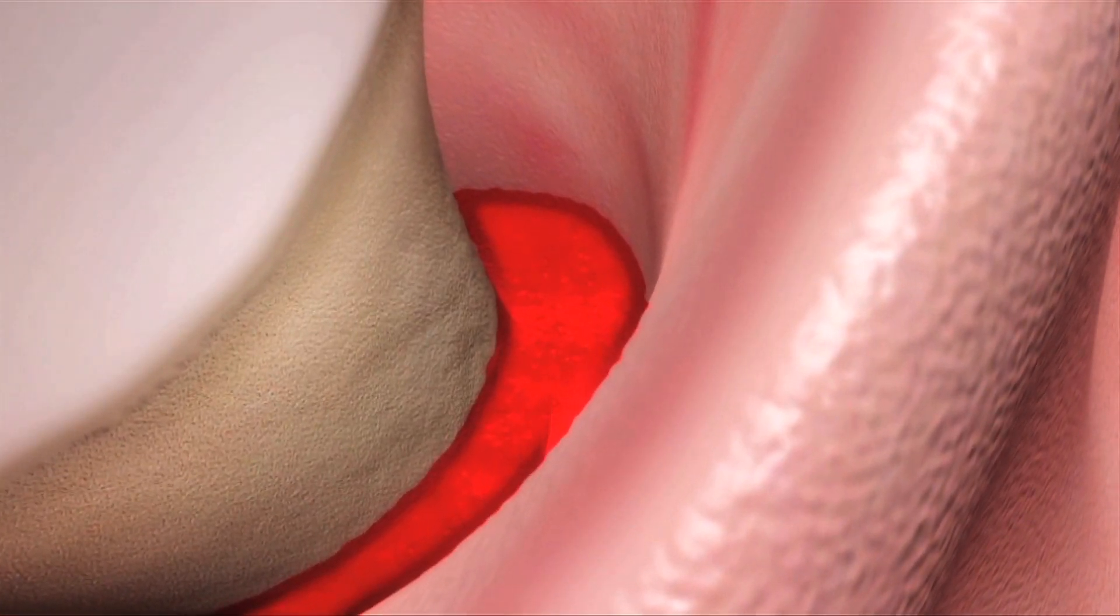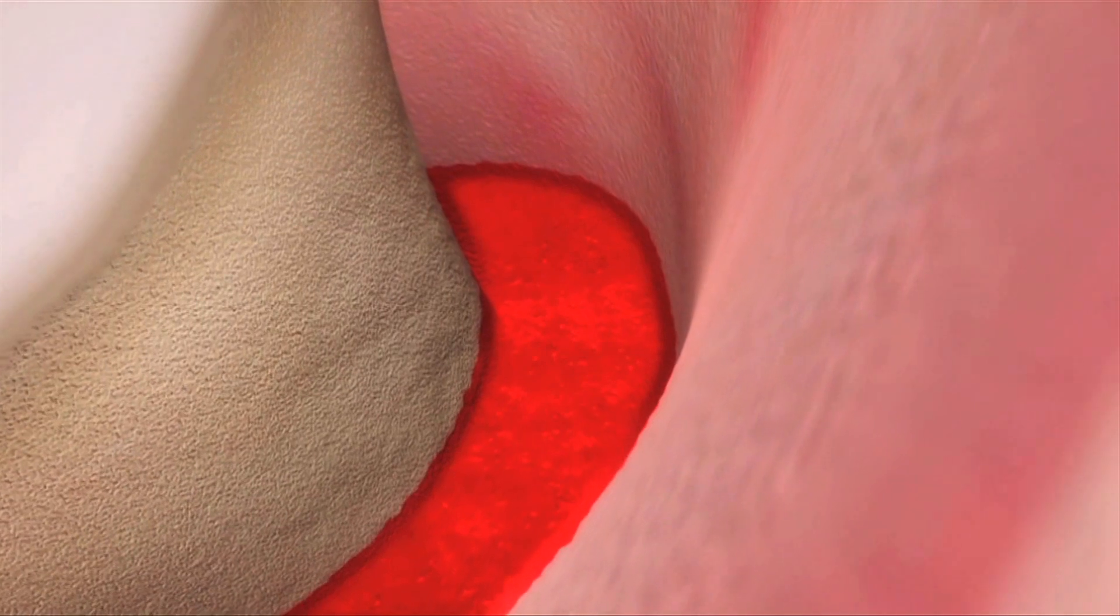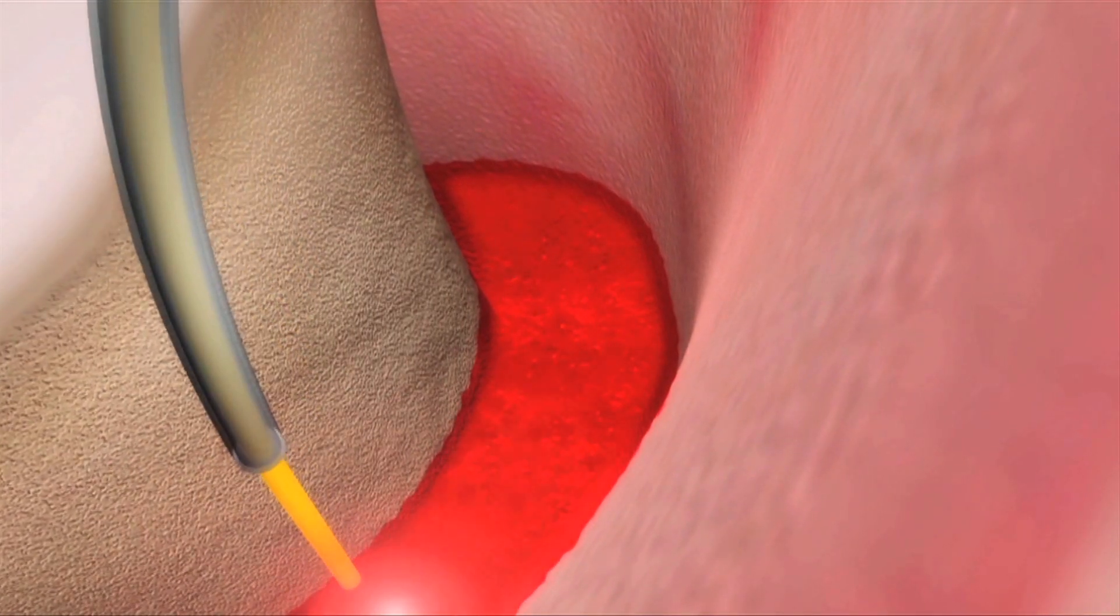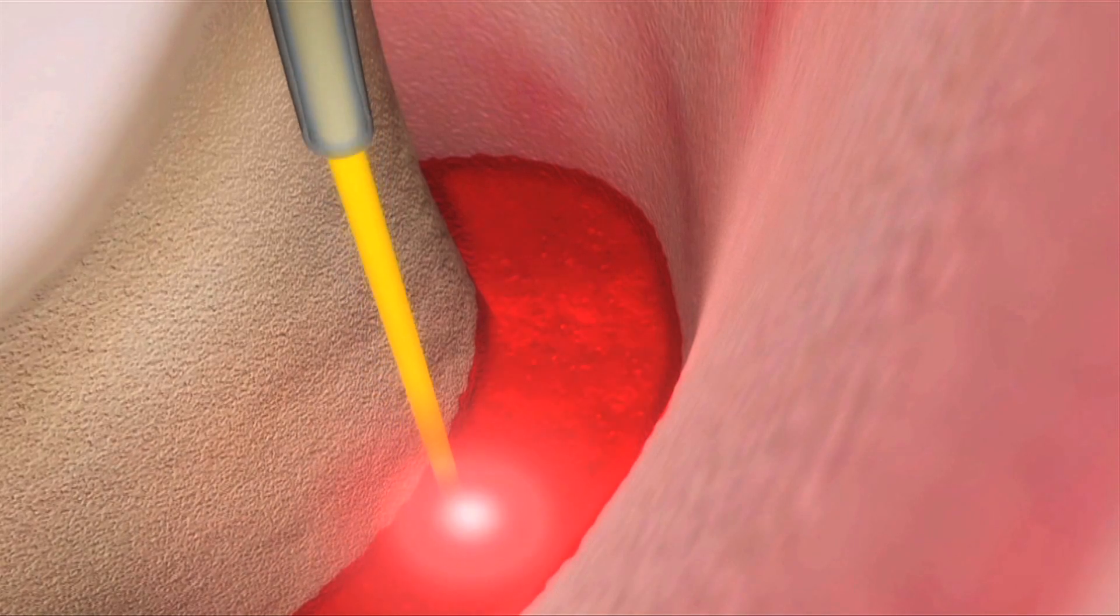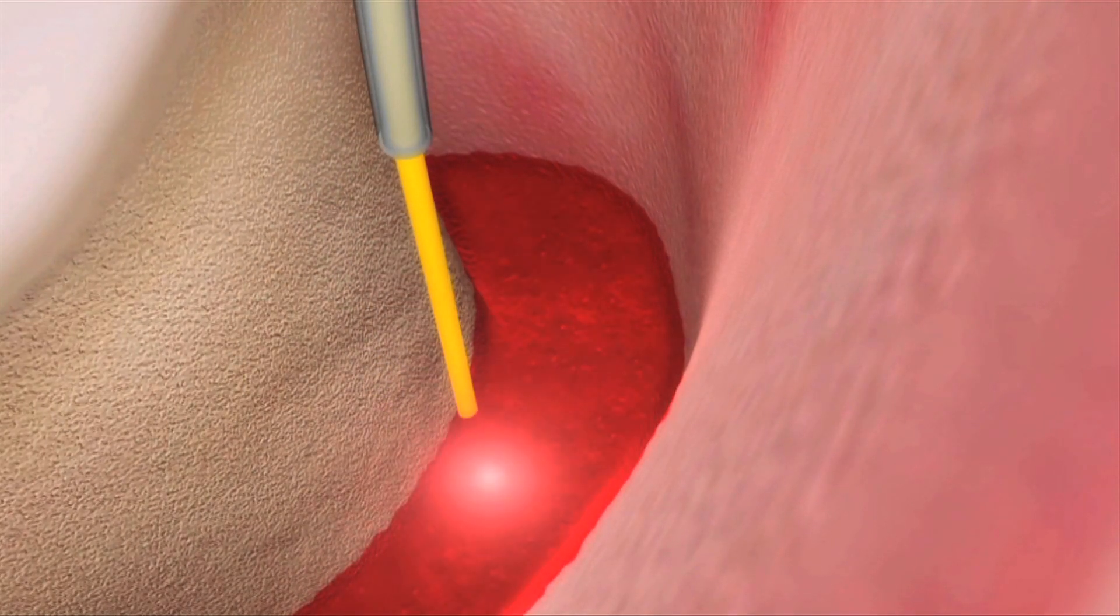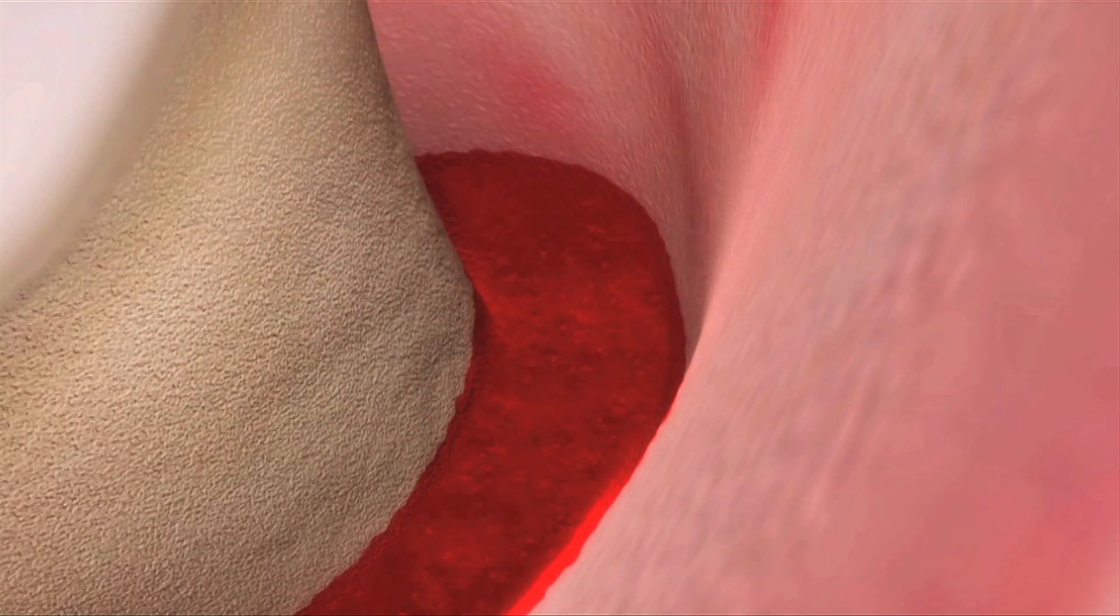Then, we again introduce ND YAG laser energy in the pocket to start development of the clot. We insert the tip all the way to the bottom of the pocket, then we fire the laser and draw out the tip until we see the blood start to get slightly darker.